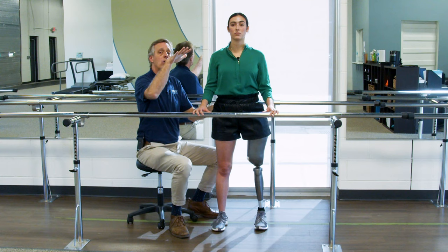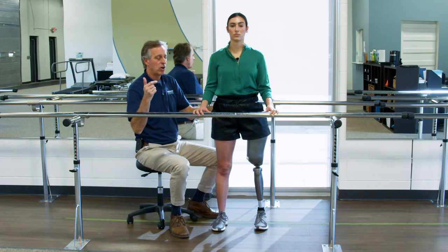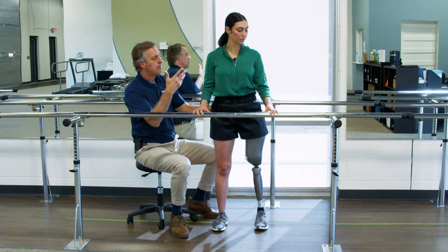Now, next thing on sidestepping is to say, if you can sidestep regular, if you can uphold balance and sidestep, the last is actually, can I sidestep with a little bit of pace? So all I want you to do now, Tracy, is I'm going to slide back a little bit. So I want you to sidestep a few steps towards me and then the other way, picking up the pace a little bit.